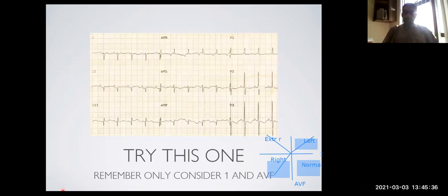All right. So this is just a simple diagram that you can use to actually tell you. Now, this is not to say this is the end of electrical axis. Electrical axis does get a little bit more complex when you have to work out the exacts of it. But if you're starting off at basic level and you want to know more or less which way the axis is going, then this is a great starting point.